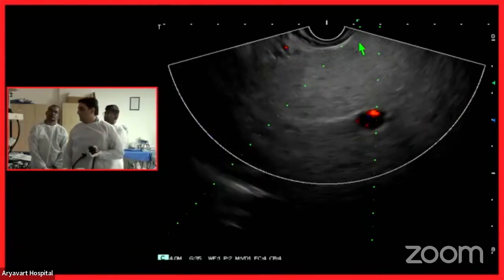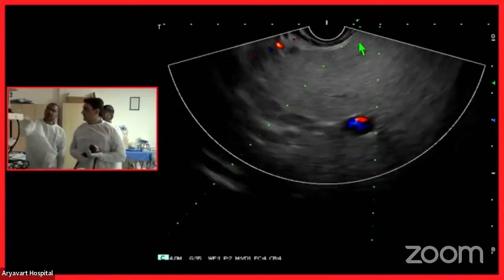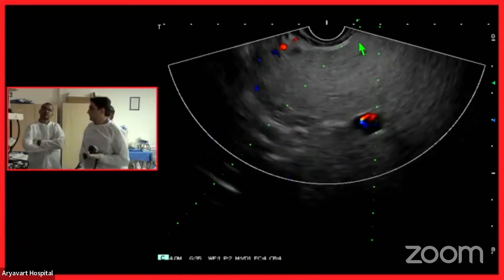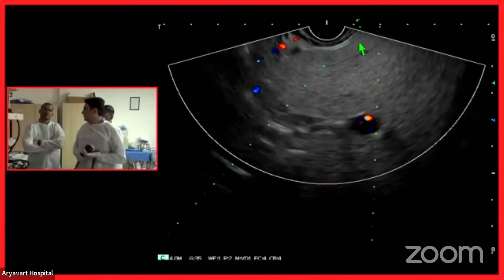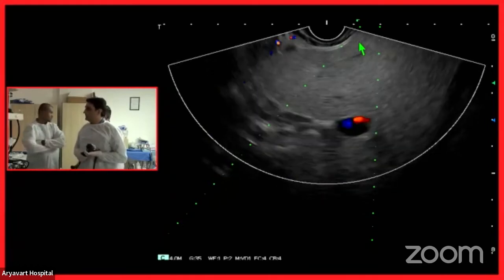So we'll take a biopsy from segment 2. You can see the needle path, shown by the marker in the US machine already, shows the avascular area. This is the benefit of EUS, because we can assess a good area, avoid vessels, and take a good biopsy.